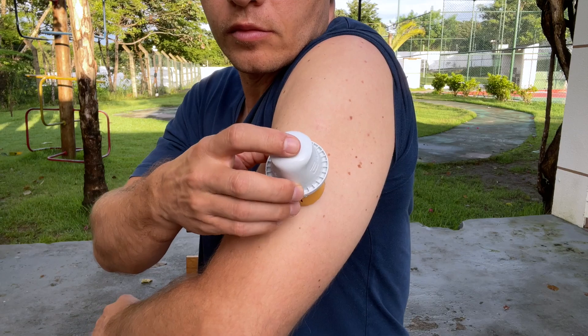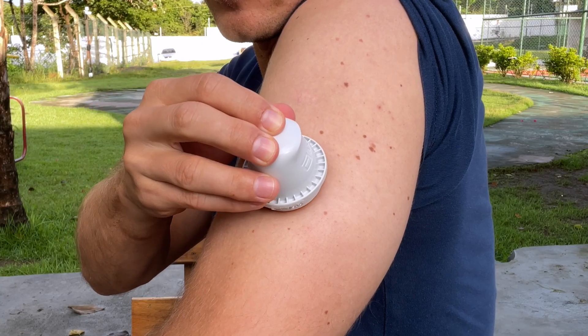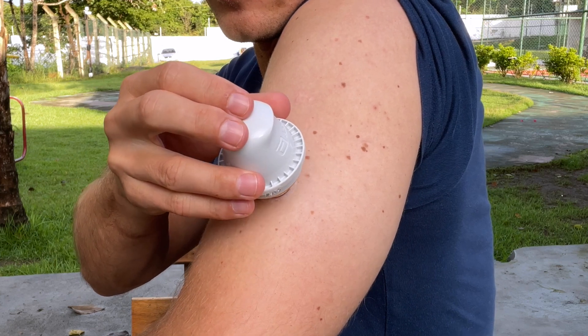Once your skin is dry, place the applicator over the site and push down firmly. Wait a couple of seconds and then gently pull the applicator away.